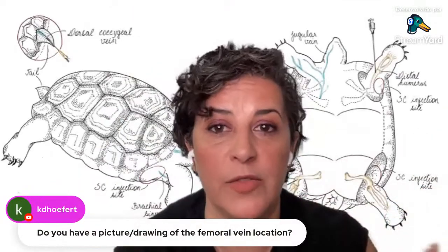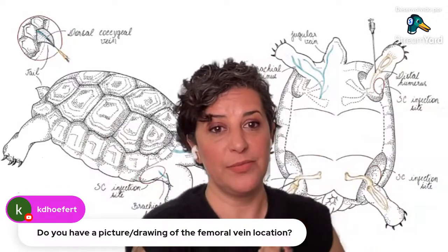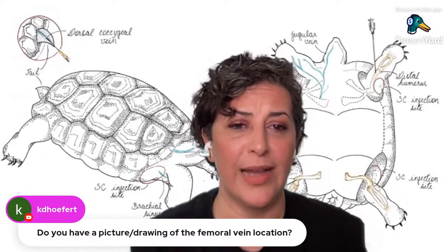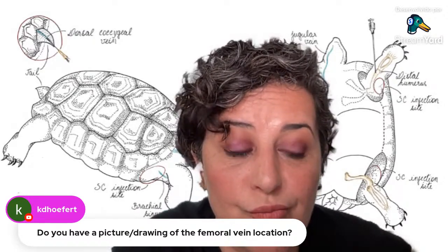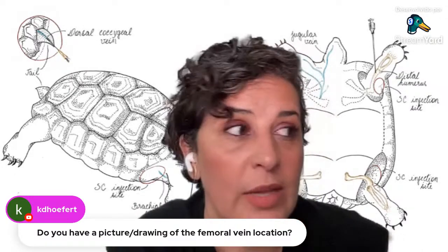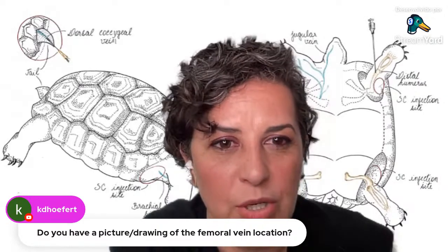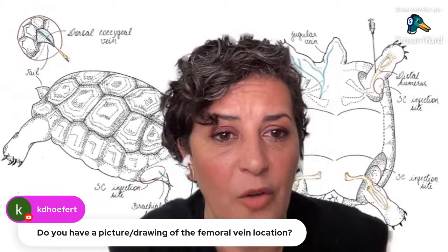And what is the problem with lymph contamination? The problem is your sample is going to be diluted. Then when you do a PCV, solids and erythrocyte count, and yes, guys, if you're not doing an erythrocyte count, can you explain to me why? This is what I ask all the labs. They go like, oh, we don't run erythrocyte counts in reptiles and birds. I say, do you run them in mammals? They go like, yeah, of course.